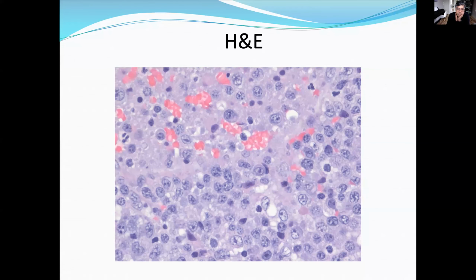And then we see cells like these. I don't know, are these small, medium, large? They look large, right? Yeah. We always use a reference for what is normal, and we use these internal lymphocytes as our normal. And by the size of the lymphocytes, these are large cells.